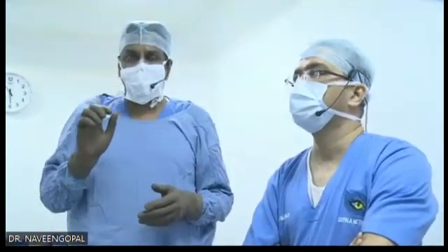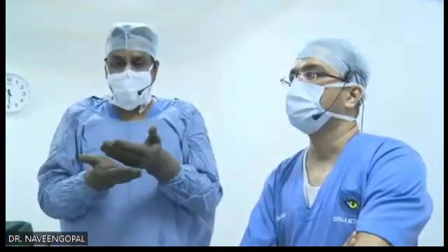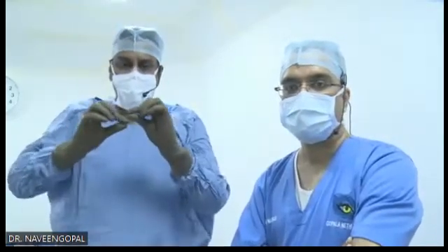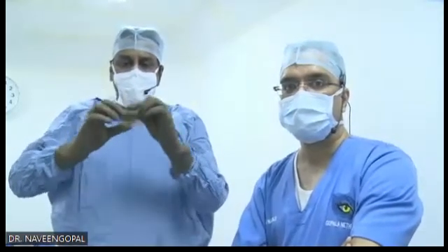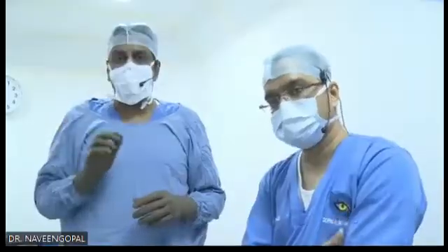Taking out the ICL is very simple. It is not very complicated. You put a lot of visco behind the ICL and above the ICL. Don't overfill it again. Hold one of the haptics, which is trailing, and pull it out gently. You can use 2 McPhersons. I call it rope and pulley technique. You can pull it out very easily. It's a very malleable lens. It comes out very easily.